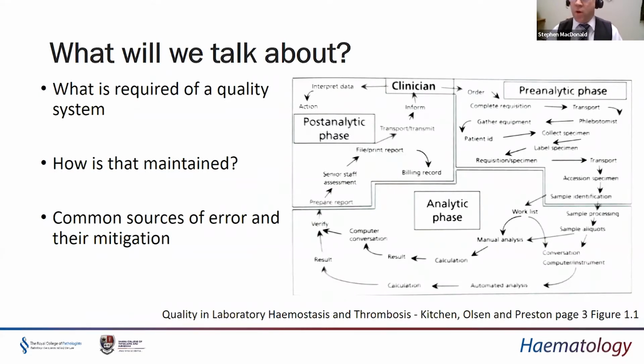There are certain requirements that we have in the laboratory that we absolutely need clinical input for. And there are also things that happen in the clinical aspect of the doctor's roles that the laboratorians need to help them and support them with. That may be in the pre-analytical phase, the analytic phase and the post-analytic phase.